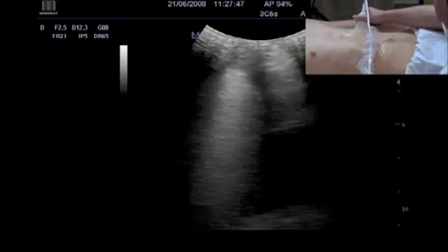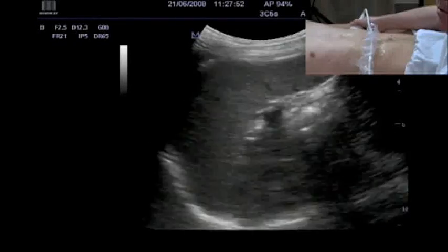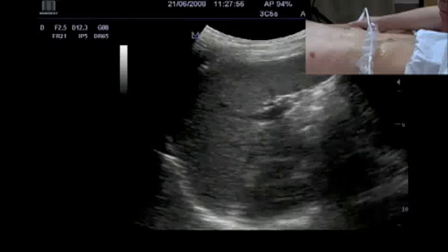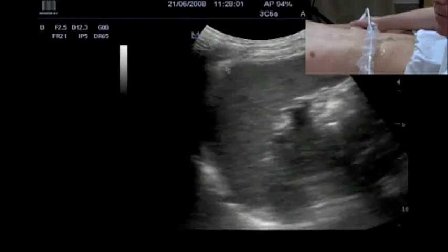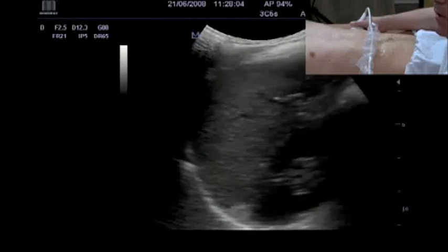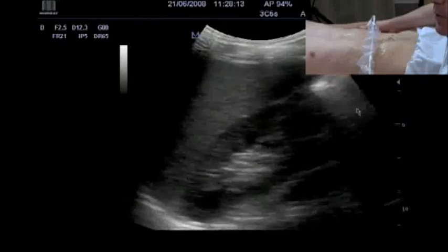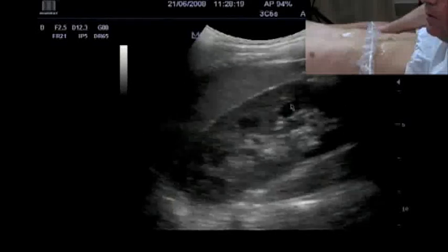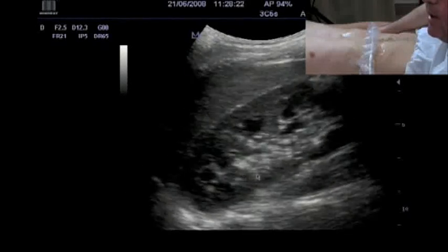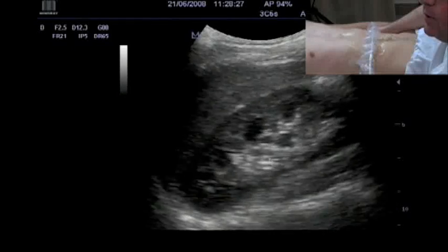Now we move to the left intercostal sections, or the left coronal plane, and we visualize the spleen. This is the spleen, here we have the diaphragm, and the left kidney, which is always somewhat hidden between the costal shadows. Also visible is the renal parenchyma, the different papillae, and the sinus renalis.